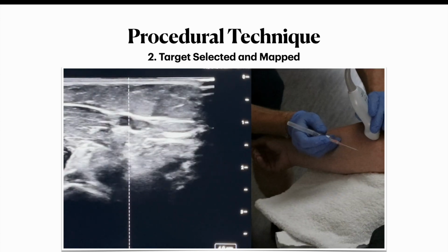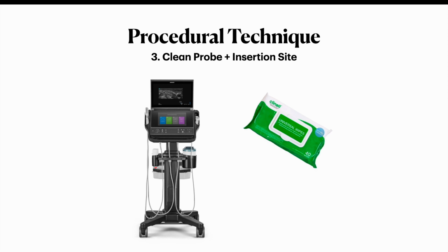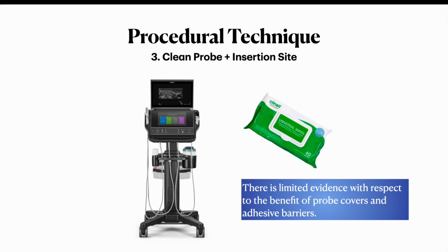The blood vessel stays nice and in the center of the screen, so we know our needle will be in the proper trajectory. But before we get to needle insertion, we briefly need to talk about how to clean the probe and the insertion site. While it has been suggested to use sterile ultrasound probe covers, or even covering the ultrasound probe with an adhesive barrier, there's limited evidence that this approach works. So simply giving the ultrasound probe and the cord a good wipe down with a universal wipe and prepping your IV site as you normally would is both safe and more time effective than the alternative approaches.